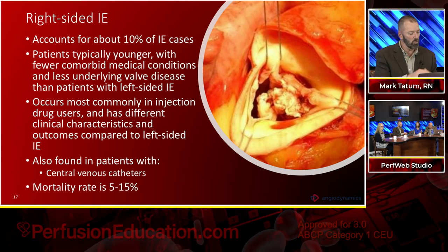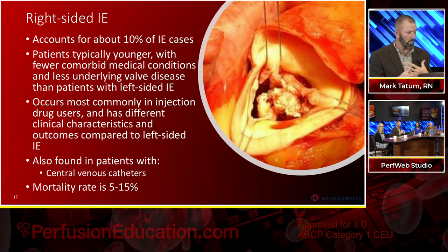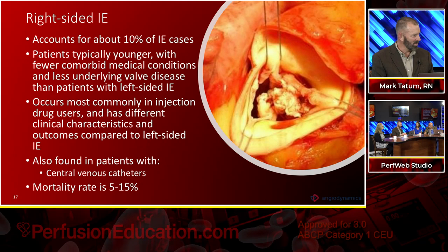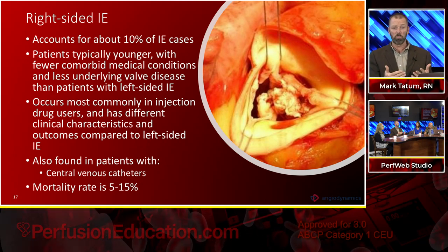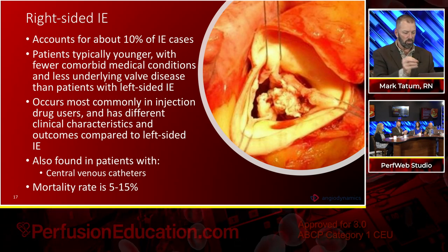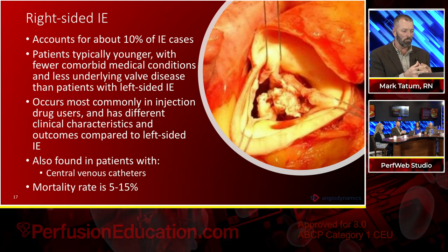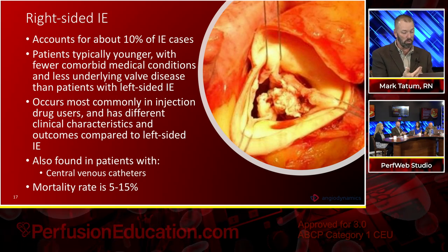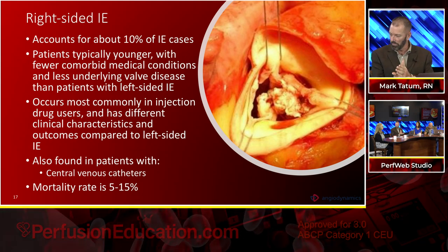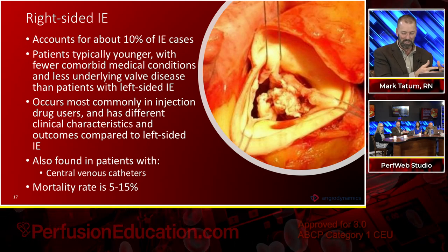One other thing I do want to mention has to do with infectious disease. One of the questions that we get quite often, especially when we're talking about involving ID, is how is this going to change my practice? If we're going to engage them, they want to know why this makes any difference to them. In some cases, we have taken the material, captured it in a filter, and sent it to the lab, and the lab does their culture directly on the material as opposed to the blood. We have had instances where they grow out between 1 and 4 different types of organisms than were found in the blood cultures.